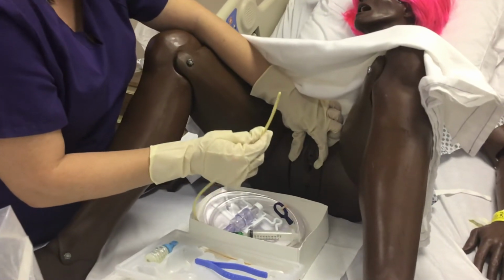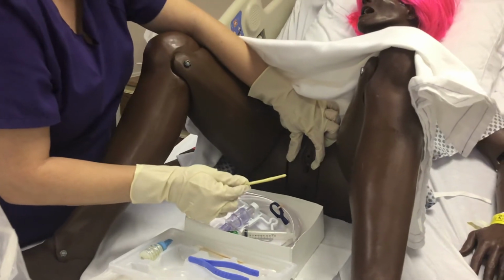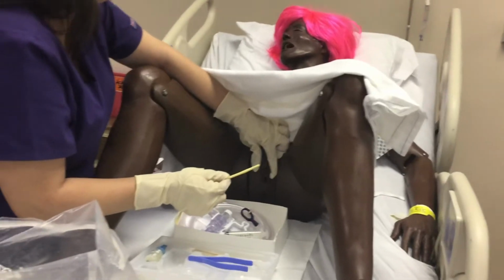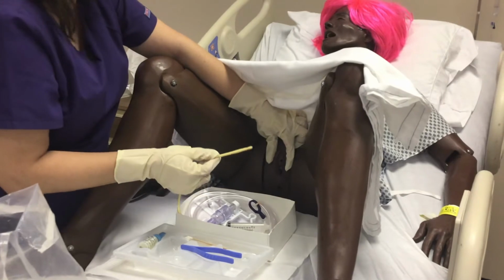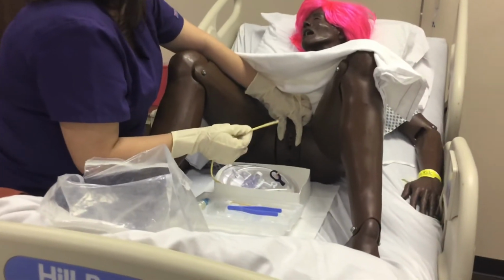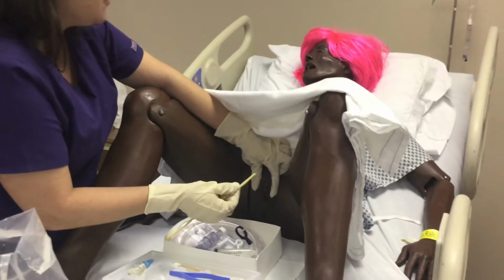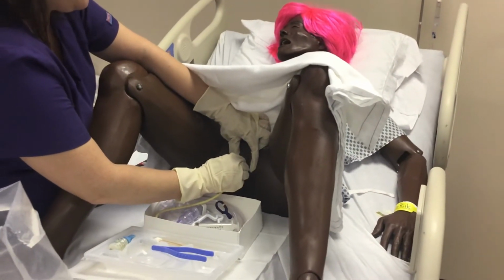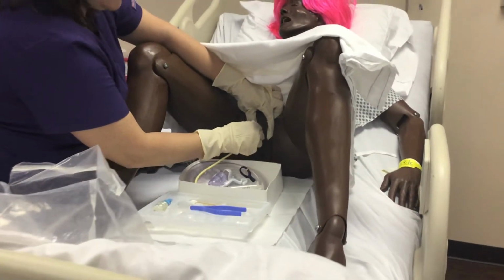Now, Ms. Shelton, this is not going to necessarily feel good, but it should not be painful. So if at any point it gets to be unbearably painful, I want you to let me know. I want you to take a deep breath in for me and then exhale it. And whenever you exhale, I want you to bear down like you're urinating, like you're going to potty, like you're going to pee, okay? All right, so take a deep breath in. All right, and let it out and bear down. Very good, very good. I'm going to insert it.